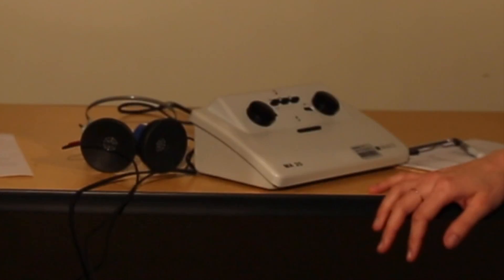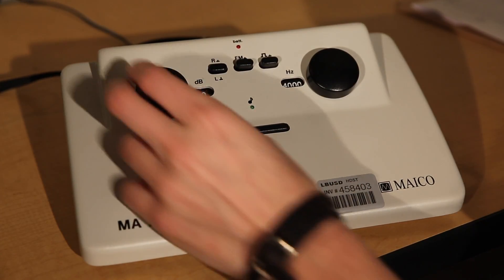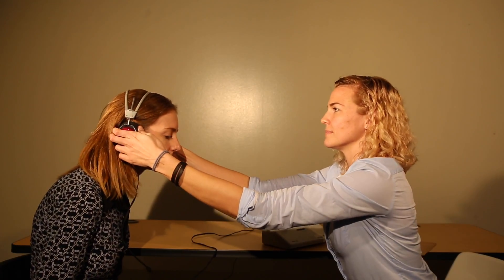The first step is conditioning the patient. Place the headphones on the table. Set the audiometer to the right ear at 90 decibels and 4000 hertz. Tell the patient to indicate when they hear the tone — they can do this by raising their hand, nodding, or saying yes. Present the tone. Turn the volume down to 50 decibels and place the headphones on the patient. The red headphone goes on the right ear. Present the tone. Once the patient understands the process, you can begin the screening.